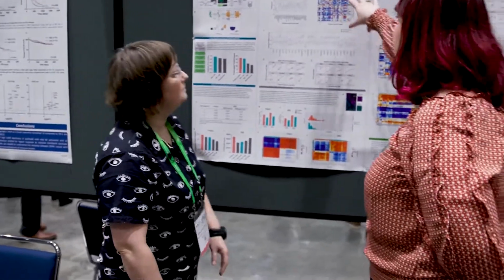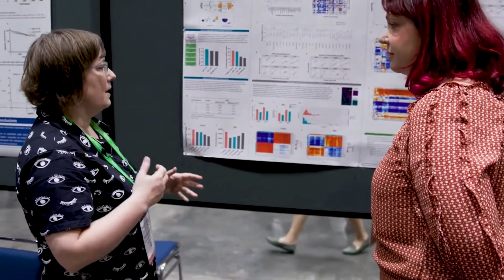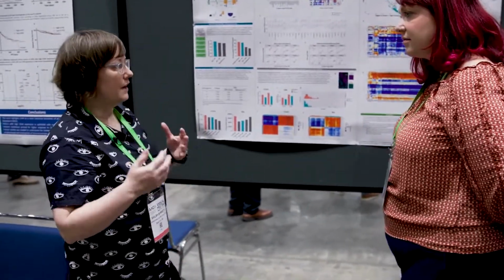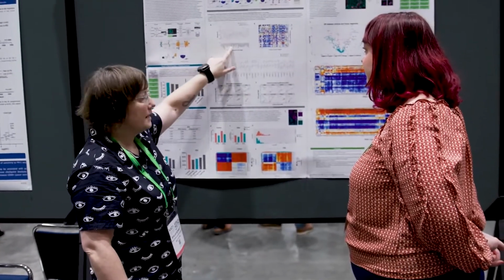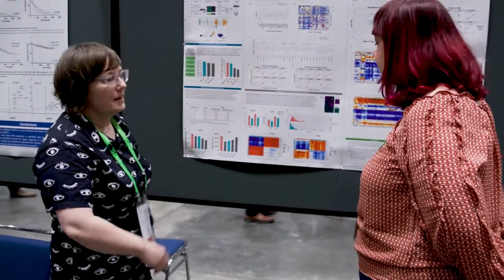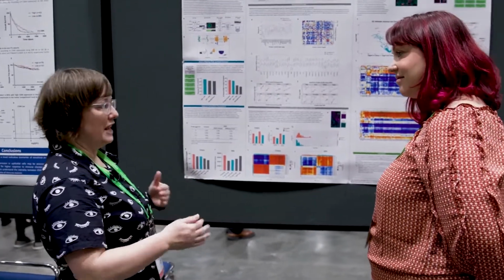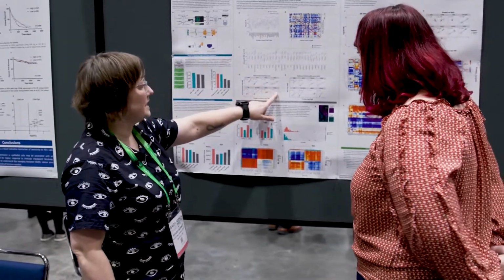So did we try first a cell pellet array and then FFPE? Yeah, we use cell pellet array as our go-to sample to evaluate performance with respect to sensitivity and specificity, and we benchmarked it against the respective single analyte control. We compared our cell line targets for both protein and RNA, but what a lot of the scientific realm is interested in is how they correlate. Even though correlation, as noted in literature, can be poor between the two analytes, there are some targets that do correlate well, and that's what we'll see here with CD45.